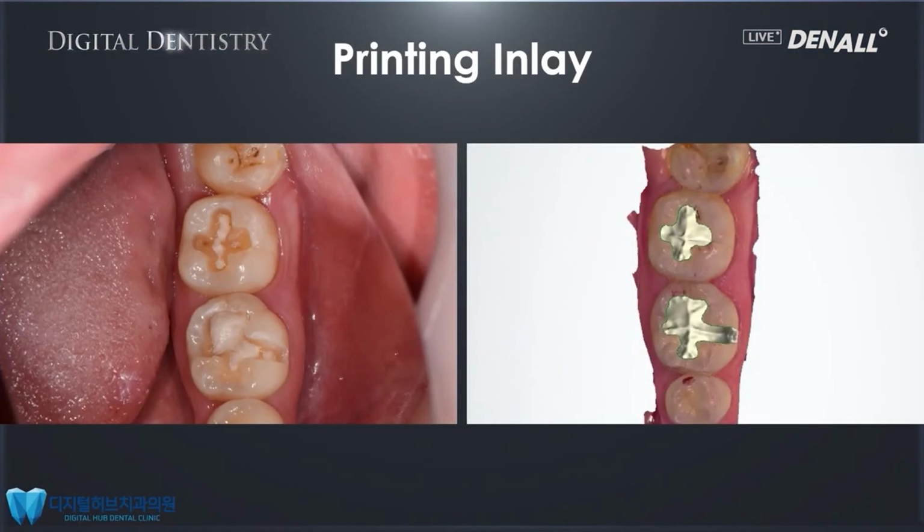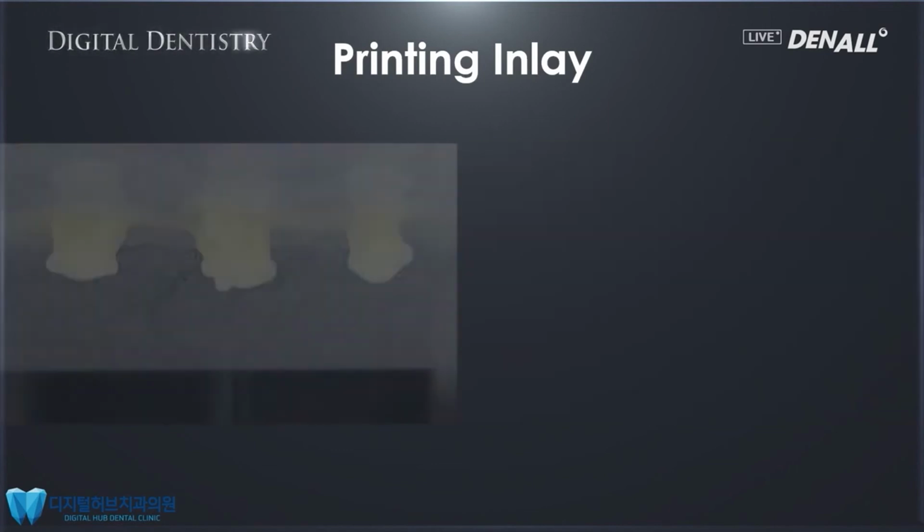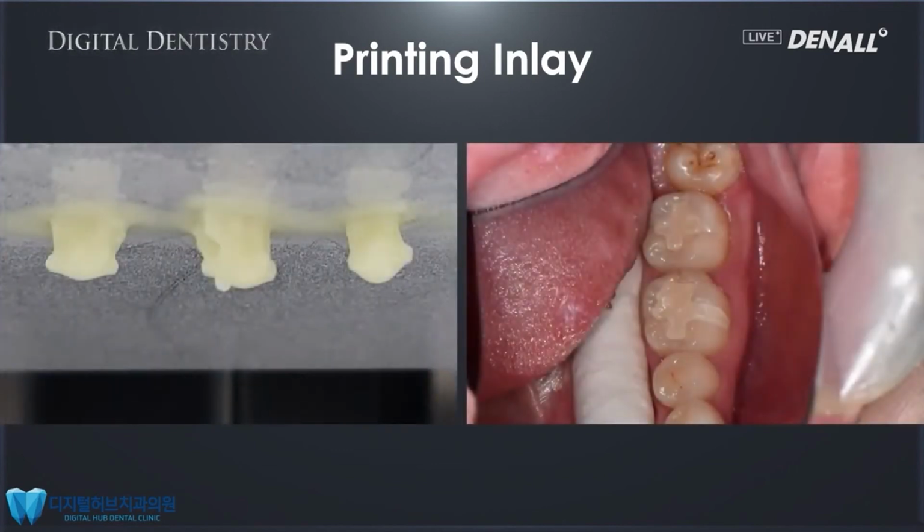Another case, on the posterior, two were prepped and scanned and designed, and the inlays were printed using the 3D printer. This time the support was all removed before it was adapted to the patient, and the inlays were fit into the mouth.